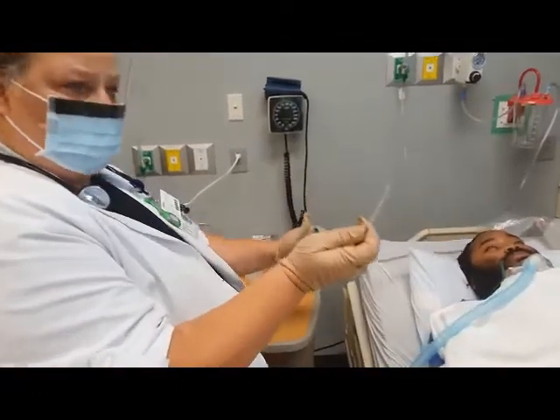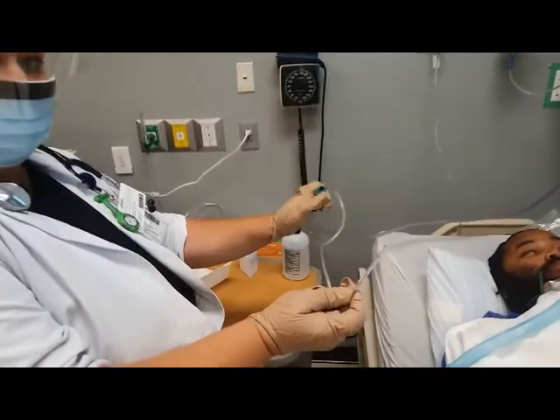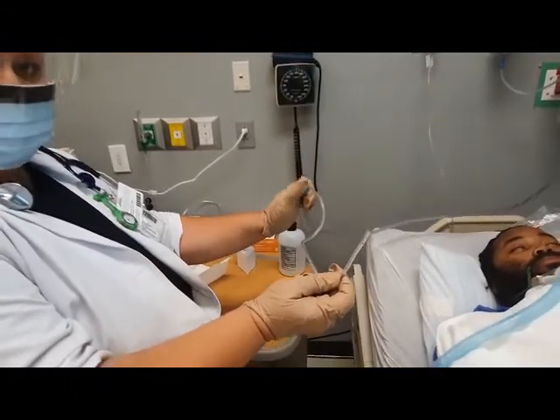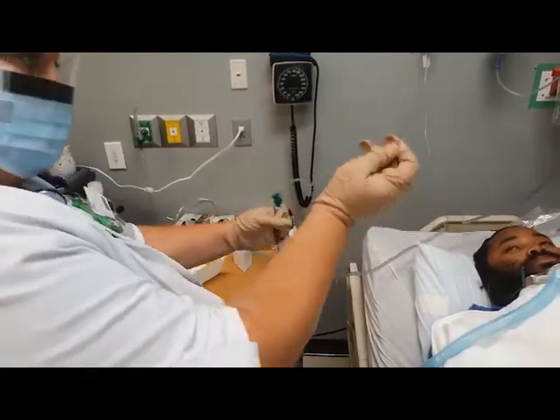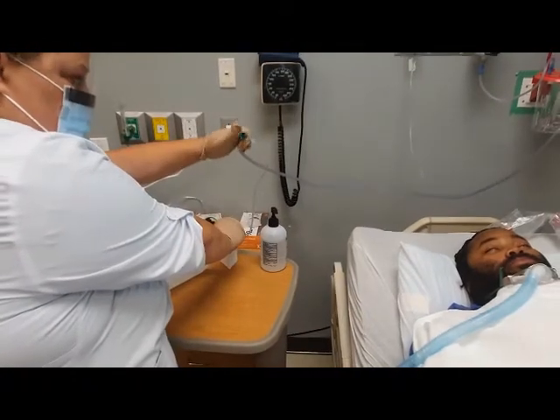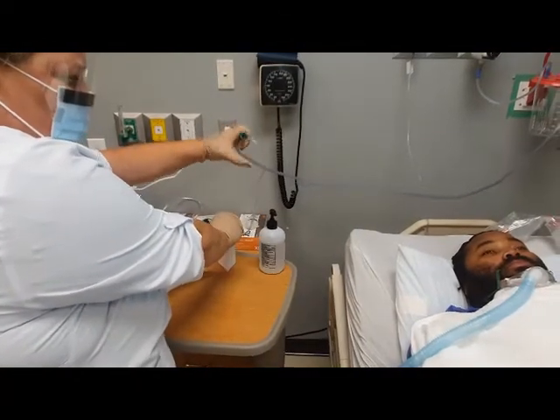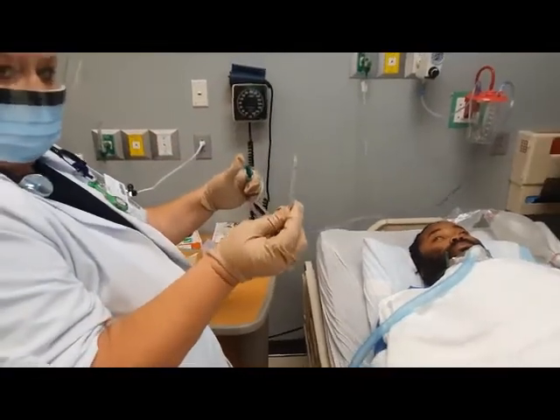And you'll suction a small amount of saline through the suction catheter to test the suction and lubricate the catheter. Okay, so you see how you have, this is the suction mechanism right here, the little green part. And when you put your thumb over it like this, that's what's causing the suction. So you'll take this into the saline, hit it a few times, and saline will come up into the tube, and that way you know it's working properly and it's lubricated.